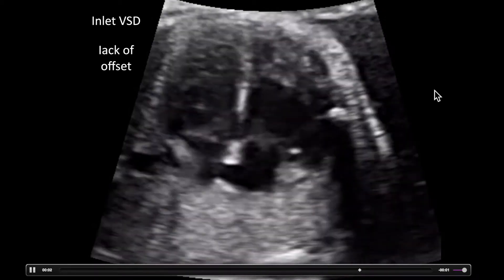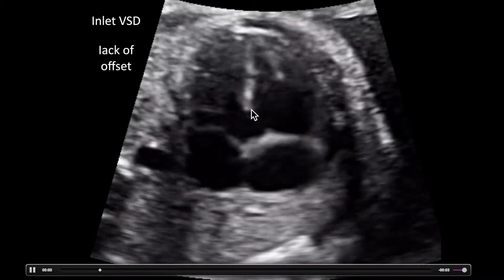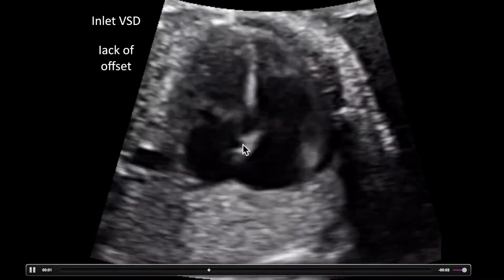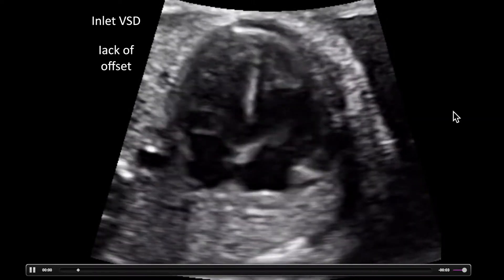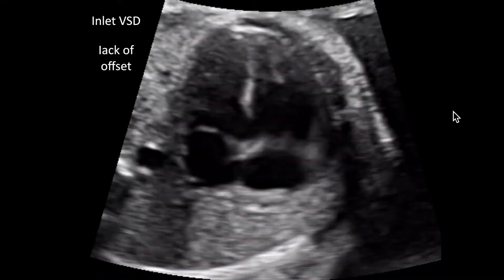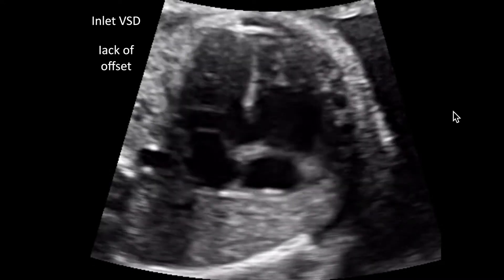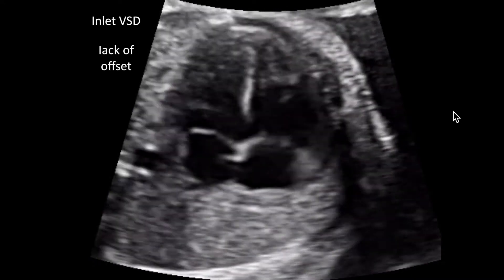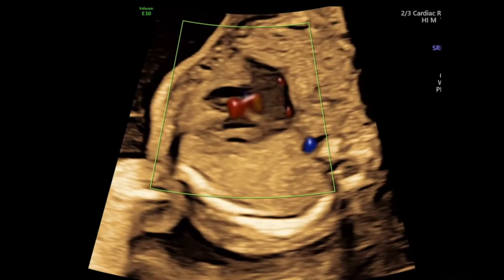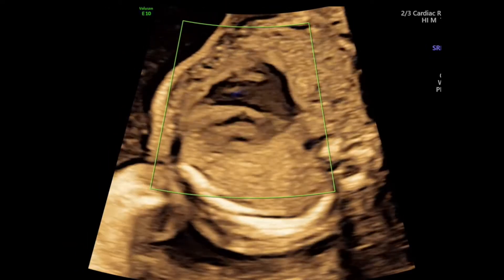Sometimes this is visualized because the blunt end of a septal defect will look brighter white, as opposed to a normal ventricular septum where you lose some of that echogenicity because the apex is up and you're looking at a very thin area of the membranous septum.